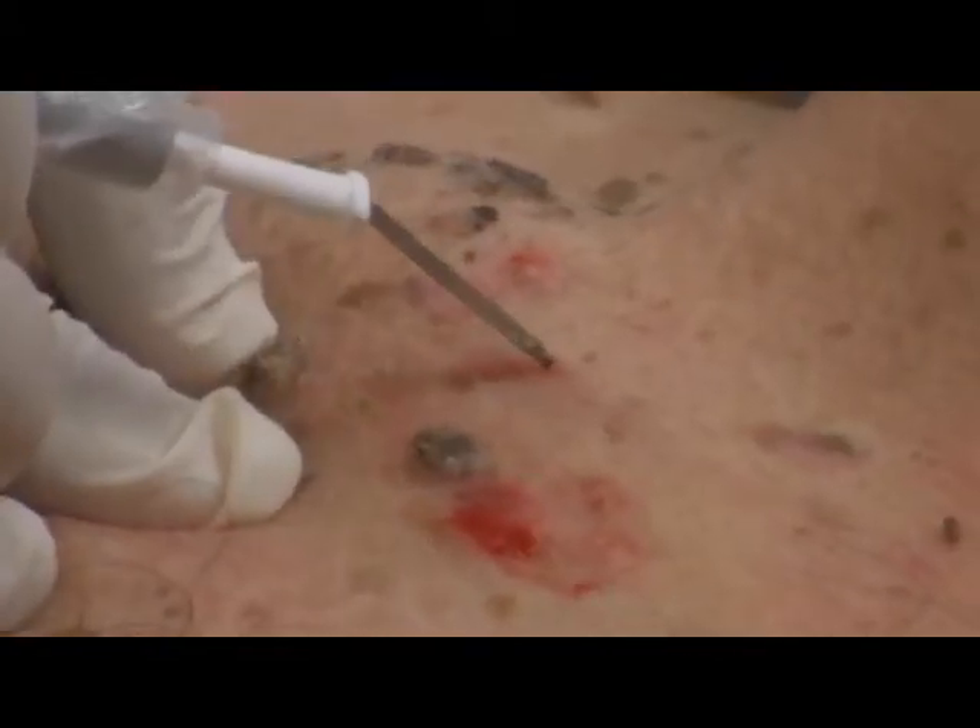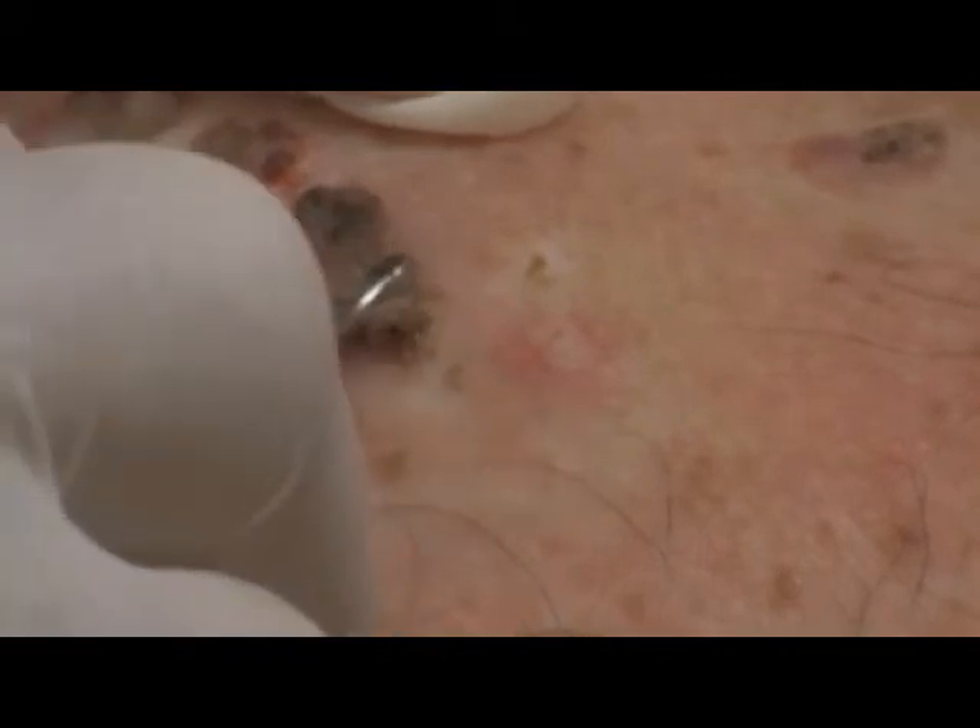For small seborrheic keratosis lesions, the tip of the A805 can be used. Having been electro-desiccated, we now proceed with the curette, effectively removing the lesion. Most of the seborrheic keratosis lesions require only one single pass. Sometimes the more hypertrophic lesions will require a second pass of electro-desiccation. If this is the first time that the patient has this procedure done, we will be re-evaluating our results in about 3 to 4 weeks to get a better idea of how the patient heals and to determine if another pass is required and if the power setting has to be increased or decreased. It is important to maintain the level of electro-desiccation to the superficial plane of the dermis to avoid scarring.